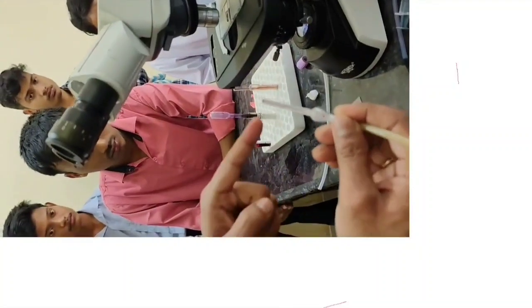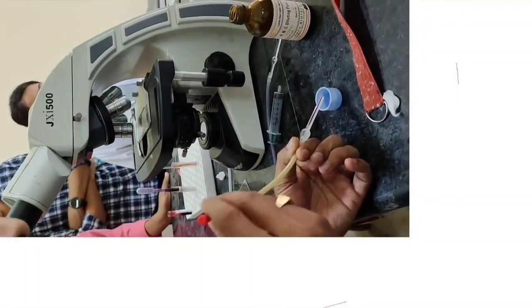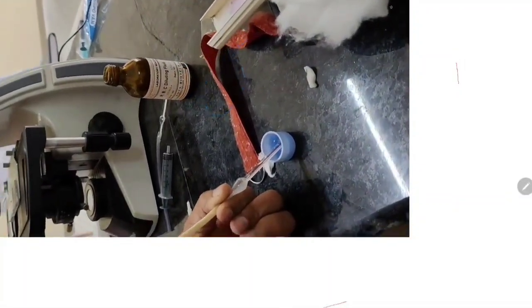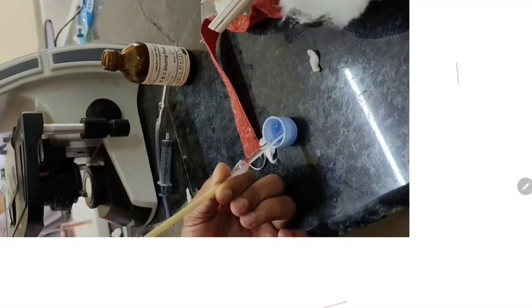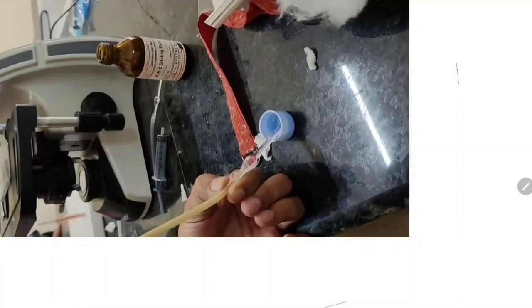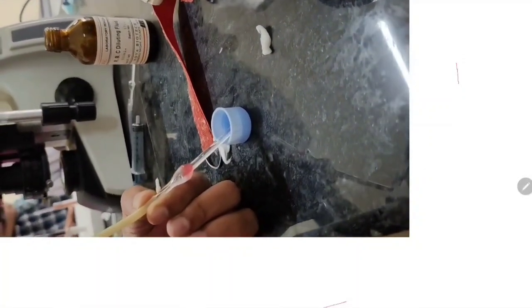So now we'll take what? Diluting fluid. Now we are ready to take the diluting fluid. This is the RBC diluting fluid and I am taking the fluid. So here one thing you must know. While putting in the diluting fluid, your pipette should be at an angle of 45 degrees or vertical.